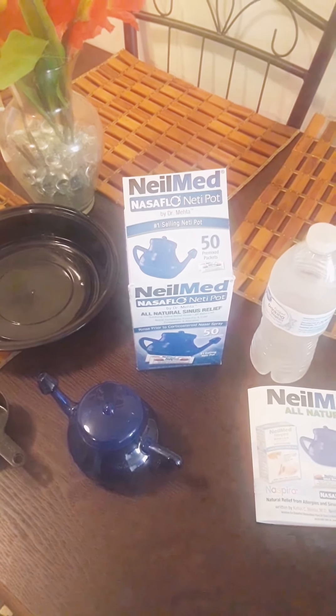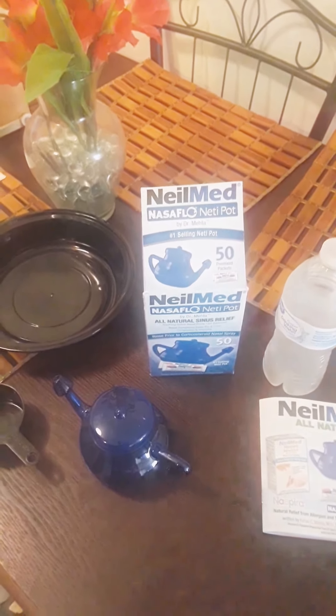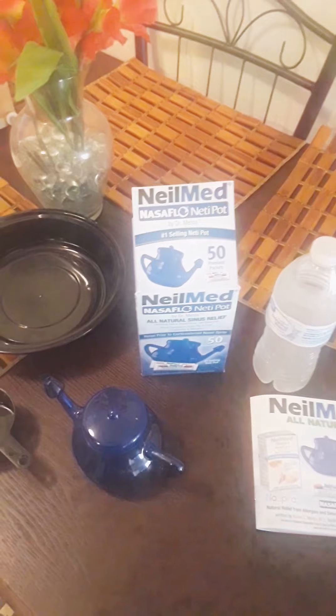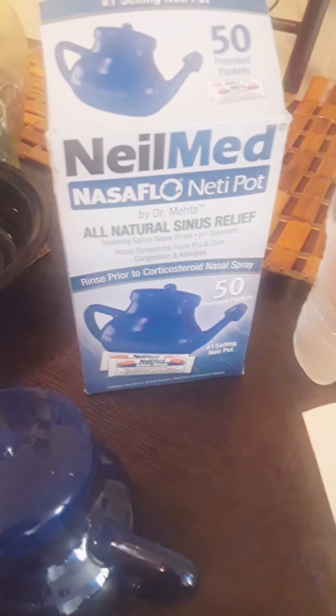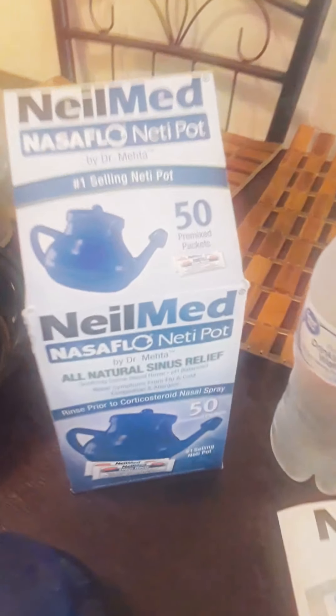I was listening to the Ricky Smiley broadcast. Eva, a model that Tyra Banks found, said that she used this a lot, and a lot of other celebrities use this too. So I wanted to try it out. I went to Walmart yesterday and got this — it was $13.86.